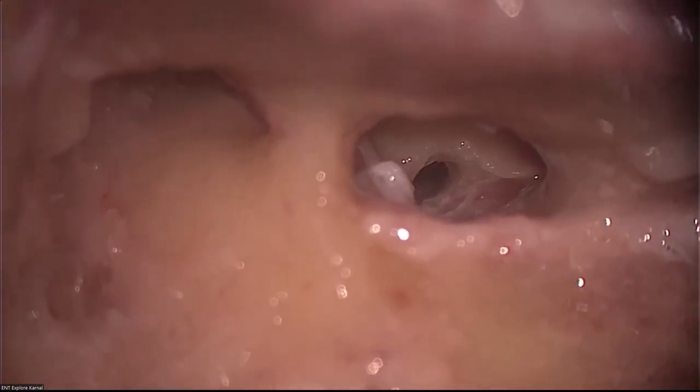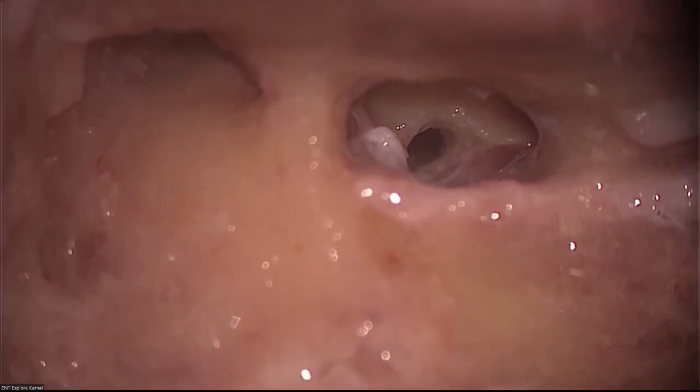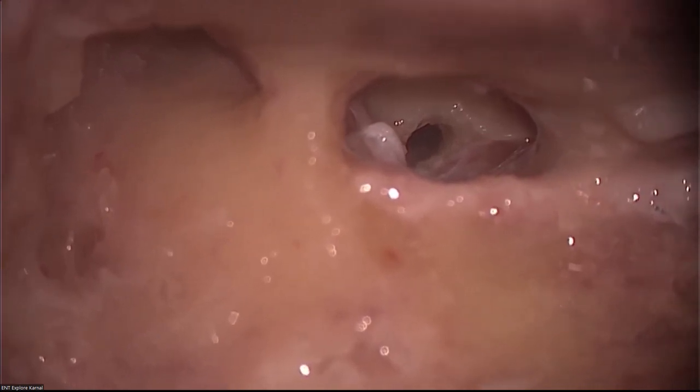What are the other lumens? What happens if the implant goes to the other lumen? How can we avoid entry into that? How is the anatomy, and how does this implant go around the modiolus? What are the other alternatives? We will see once we uncover the anatomy of the cochlea.